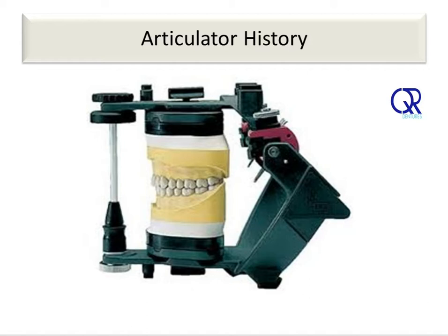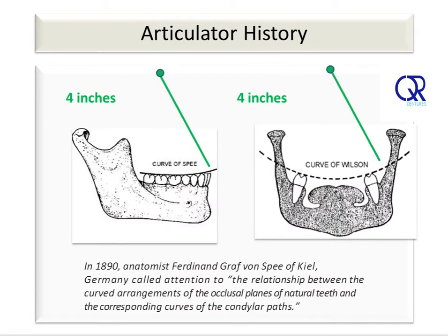The dimension of 4 inches is also used in the design of all of our modern semi-adjustable articulators. Bonwill's assumptions still influence dentistry today. The compensating curves we use in dentistry on a daily basis have not been developed through meticulous research. They have been created to match a set of beliefs. It is important to realise that these beliefs lead us to the conclusion that lateral movements of the mandible are the same on both sides, and the movement is of a linear nature, that is, a straight line.